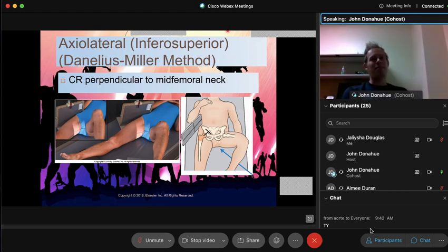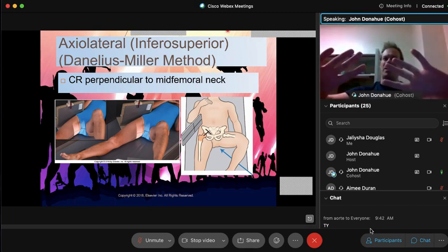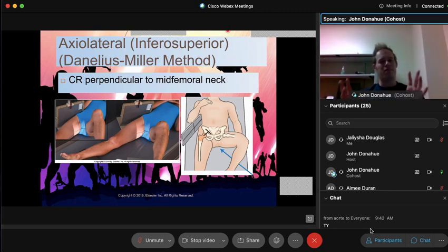Now, look, this can be a very tough X-ray, guys, but it's really not as bad as it looks. It looks terrifying. It looks complicated. And yes, there's a lot more steps instead of a normal hip X-ray, but it's more of a mind over matter thing, guys. You're literally just lining right back up to that femoral head at the crease of the leg, making sure your cassette's right behind the patient's hip, making sure you're lined up, tube 40 inches, and just shooting your X-ray. It looks more complicated than it is. So, yes, we got to do a cross-table beam, which can be a lot different than we're used to, but this actually produces a very beautiful X-ray if you do it right.